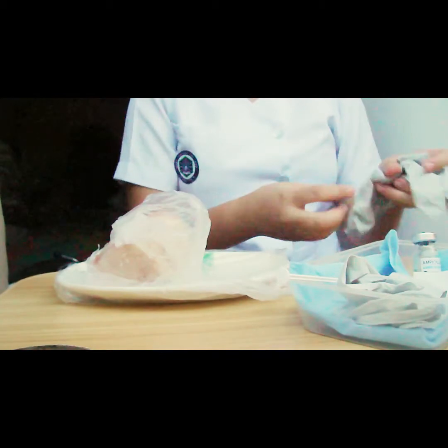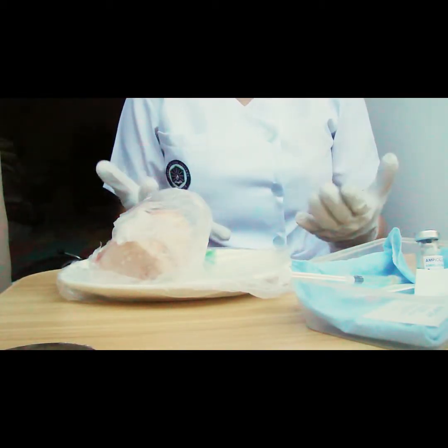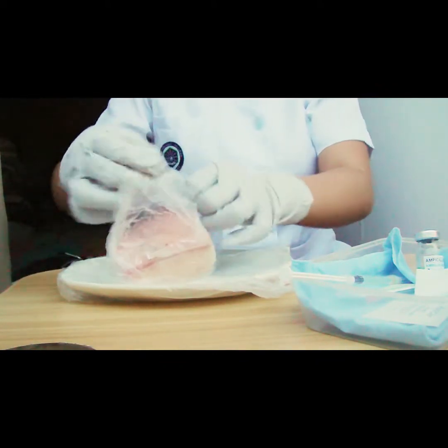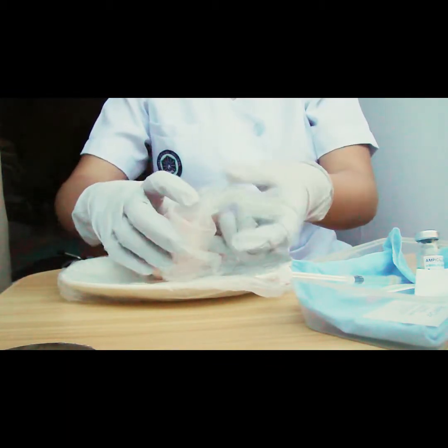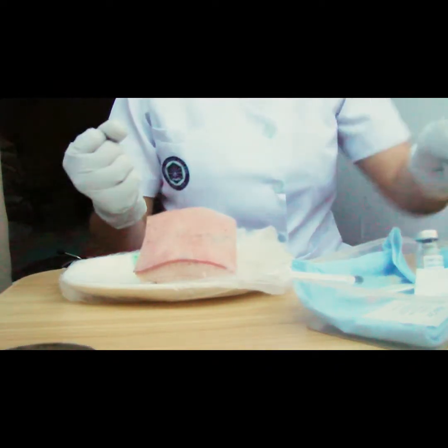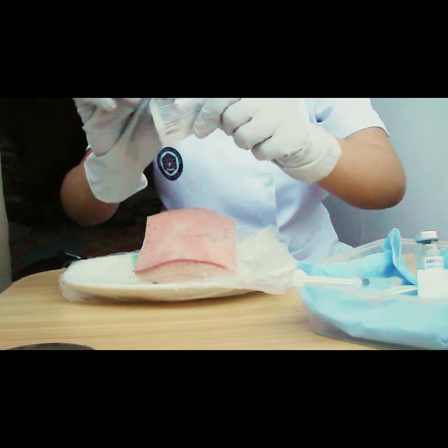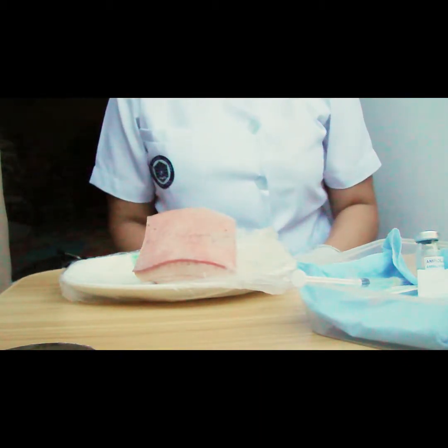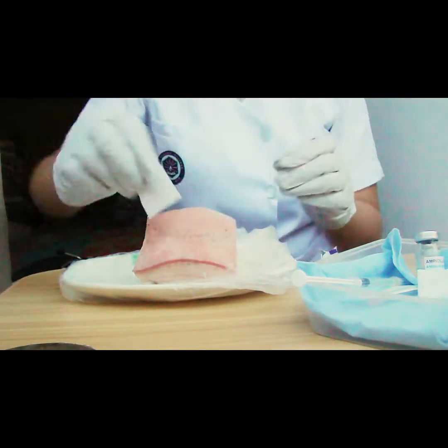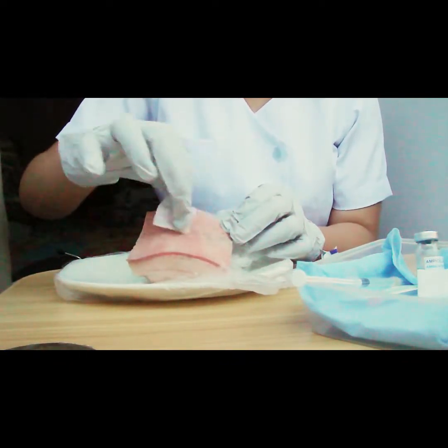So the first thing that we're gonna do is to put on the gloves. So now that we have put on our gloves, I'm gonna use the baboy, kasi hindi pa ako marunong sa tao. Cleanse the skin at the site using a firm circular motion, starting at the center and widening the circle outward. And then allow the area to dry thoroughly.